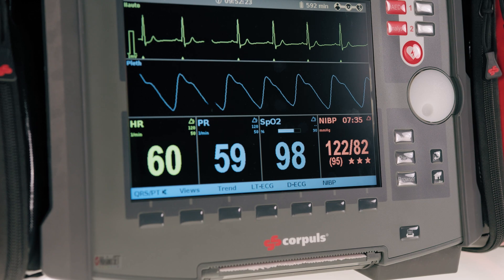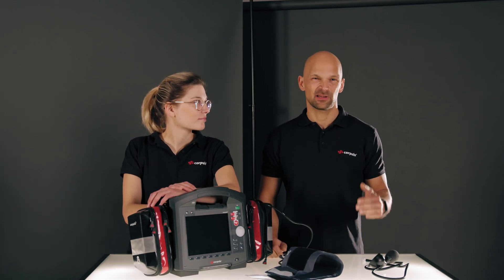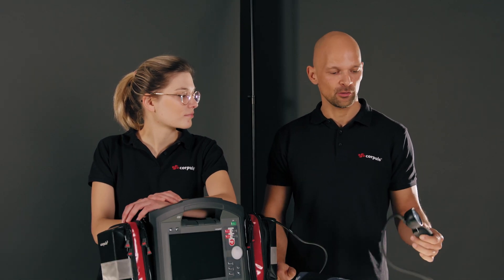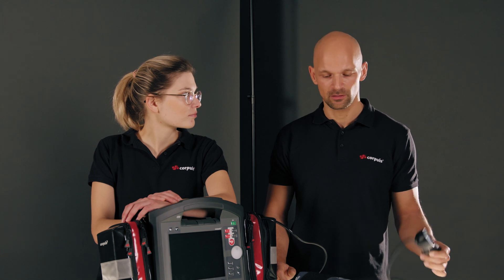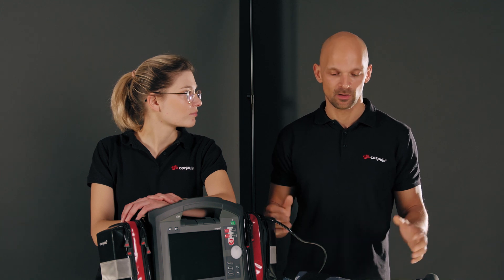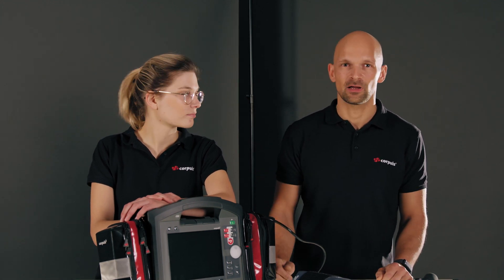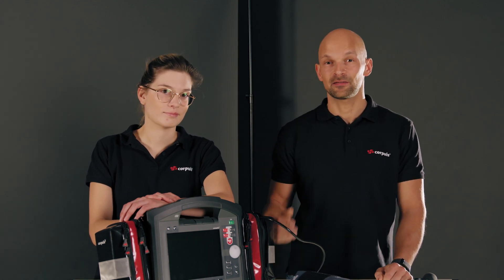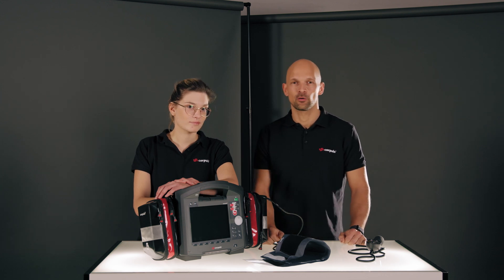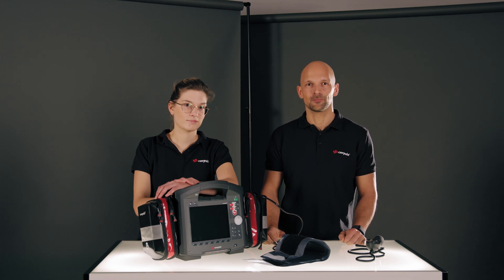We just showed you the blood pressure measurement on the Corpulse 3T. The core element of the video was to enable you to take a valid measurement. We discussed the importance of a manual initial measurement, then choosing the right cuff size, and gave you an overview of which cuffs are available. Verena led us through the blood pressure menu and explained the individual parameters, and then I explained the quality index. Verena also explained the advantages and limitations of the RMT. We hope it was of some help to you, and would love to see you back here soon. Bye!